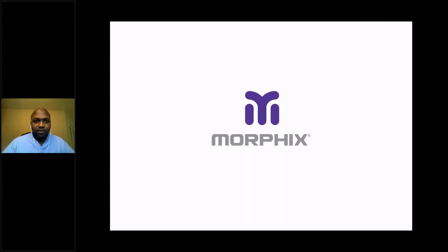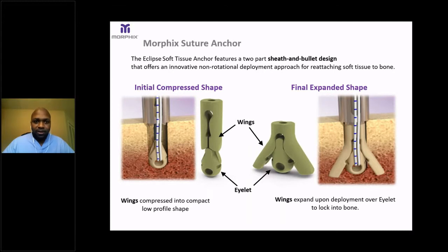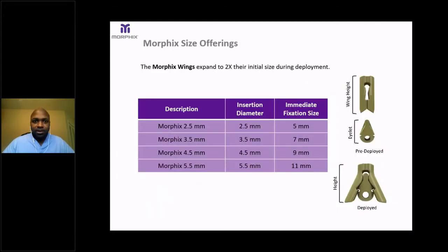The Morphix suture anchor is a two-part sheath and bullet system. There is an eyelet, as you can see, and the eyelet is surrounded by wings. The wings are what change shape when deployed. On the left, you see the wing and eyelet together, but the wings are compressed into a compact, low-profile shape. Upon deployment, the wings expand over the eyelet to lock into the bone and increase the surface area. The wings expand to approximately two times their size from initial insertion to deployment. The Morphix sizes range from 2.5 to 5.5 millimeters, and the size of the implant essentially doubles once deployed.